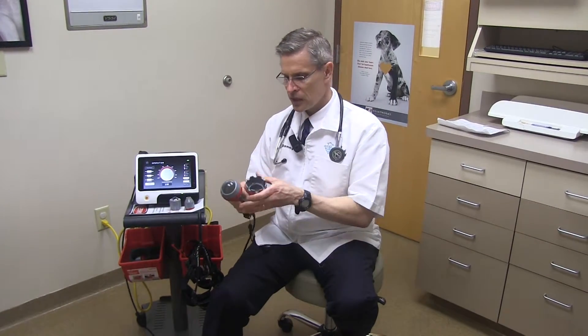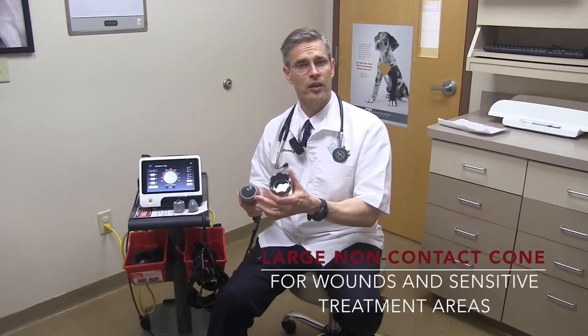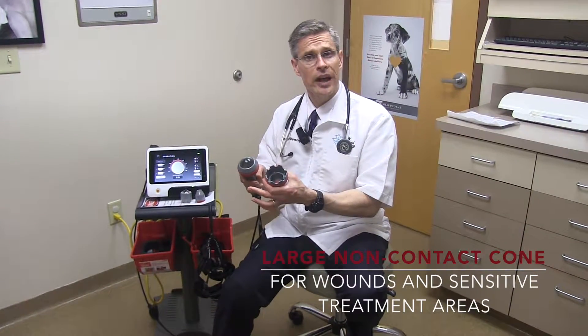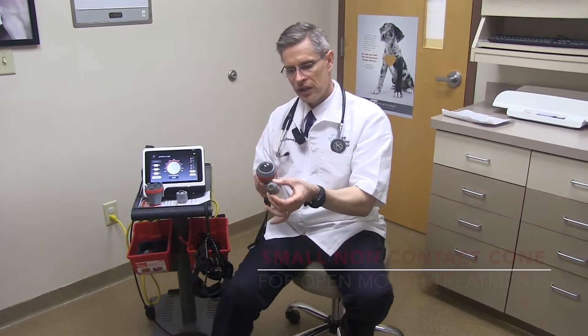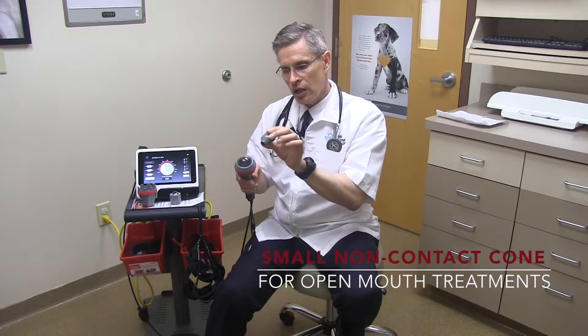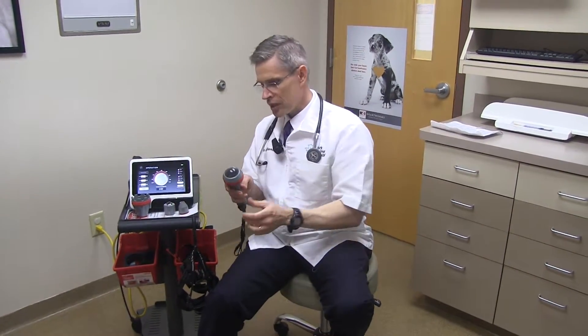Then if necessary, we'll shift to a non-contact head that simply screws on and off very quickly for my staff. The non-contact we're going to use on something where the animal is super painful and we don't want to touch that — we'll use it for wounds. This small non-contact head here is just fabulous for getting into the gingival tissue, because when they're asleep we'll actually go intra-orally with this rather than going through the cheek. It gives a really nice directed beam.